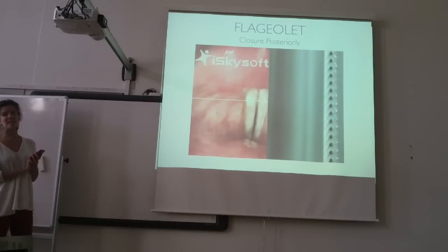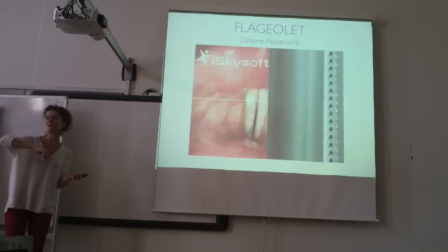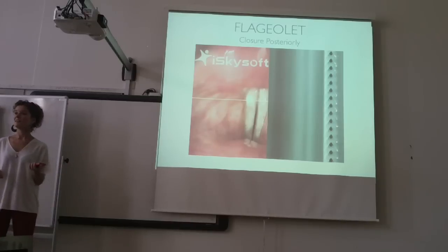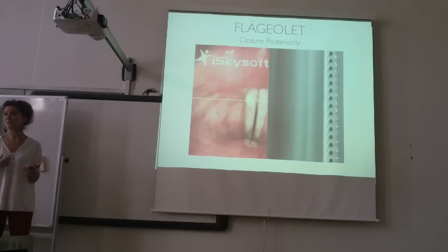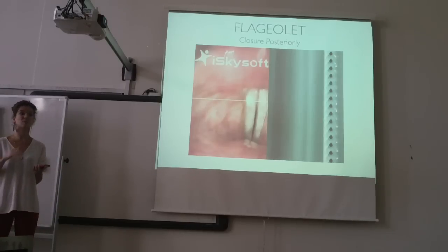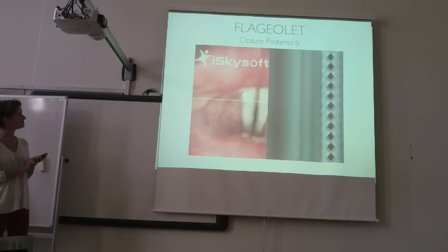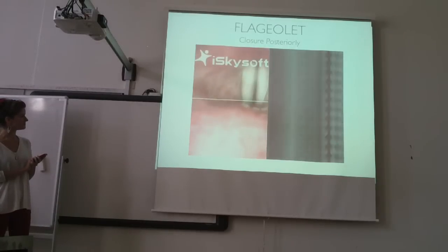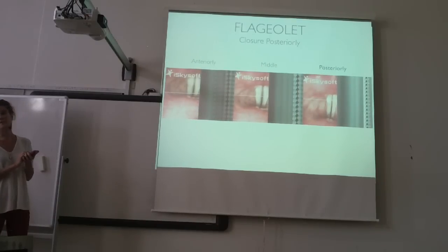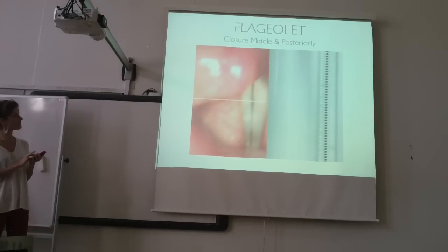This is where we only see posterior closure. Actually, I have only found this image 2 days ago when, from a recording session in 2012, we were just playing around with the camera, not knowing it yet because it's a very new technique. So this is not from the protocol where I asked them to produce single notes. This is a song. And here we see that there's only closure posteriorly. And this one we see closure in the middle and posteriorly.